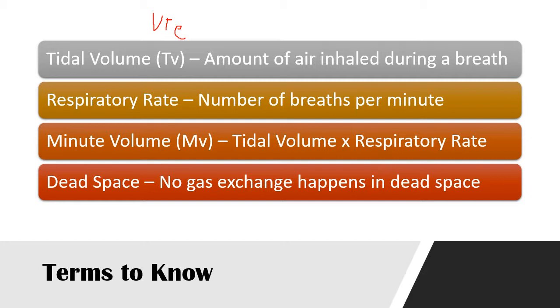Respiratory rate is your number of breaths per minute. Your minute volume, that's your tidal volume times your respiratory rate, the amount of volume you're taking in every minute. Also an important setting: dead space. We talked about dead space a few slides ago. That's the place where no gas exchange is happening. The only place that gas exchange occurs is in the alveoli. Everything else is just dead space. So we have to calculate that when we're thinking about ventilating a patient.